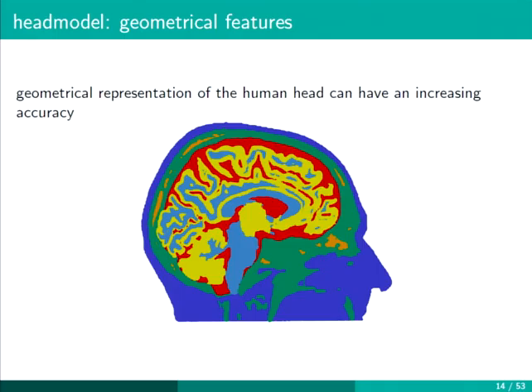It's a kind of long procedure to calibrate it, but we basically do a reconstruction of the PN20 component of the somatosensory data and optimize it using the different strengths of EEG and MEG. Then we compute the residual variance to the EEG data of the optimal dipole, and we repeat that for a lot of conductivities of the skull. And then we compare the results, and we check for which conductivity we get the best fit.